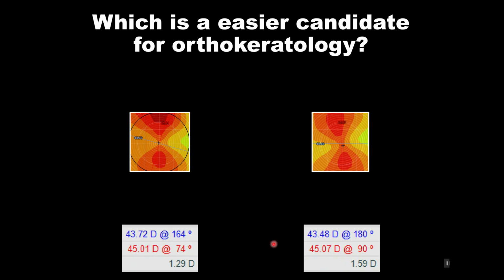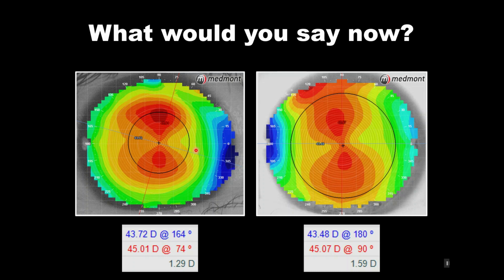Notice very close in central corneal astigmatism, only a 1/4 diopter separated, and an appearance that is relatively similar. With the rule, flat K is horizontal, steep is vertical. We see that hourglass astigmatism. Well, let's blow it up. Let's look at much more of the periphery. And here we see that we have very much an apical astigmatism, in this case, very much a limbus to limbus astigmatism in this case.